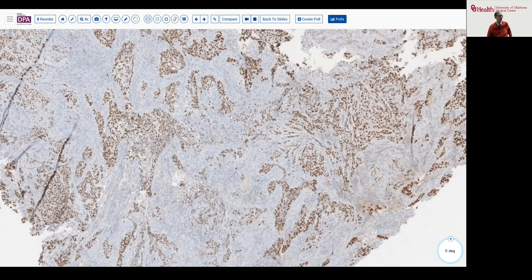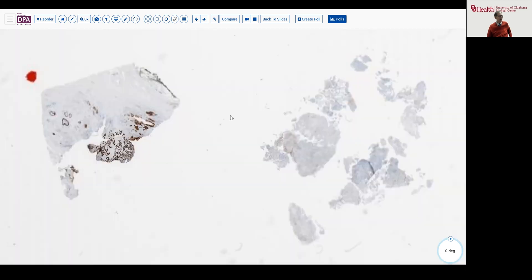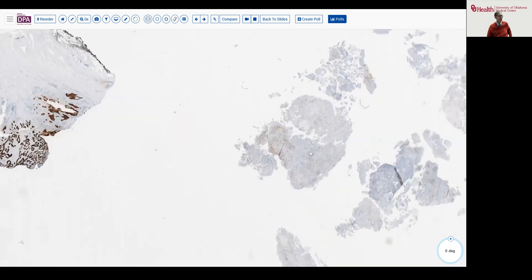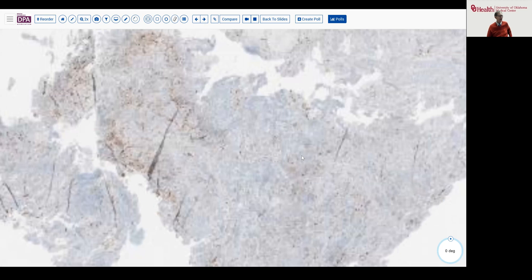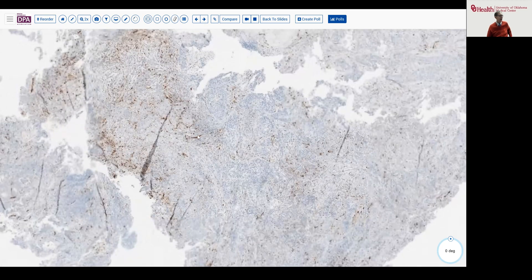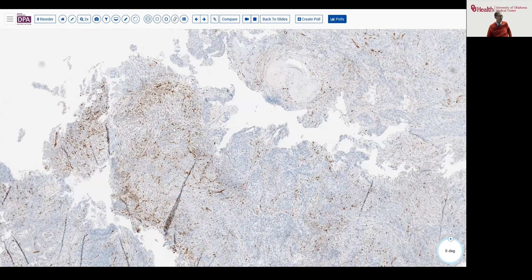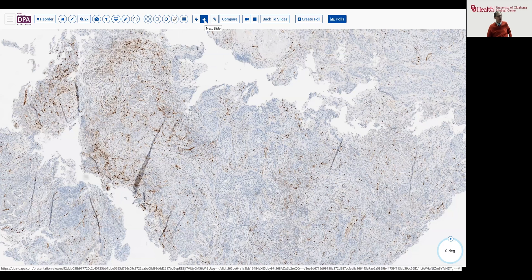Finally, our P16 stain — as you can see nicely in the control tissues, both squamous and adeno — shows essentially no significant positive staining in any of our tumor cells. We do have some nonspecific splotchy staining in the inflammatory component of this tumor. Based on these findings, we would render a diagnosis of HPV-independent squamous carcinoma, which is an important distinction.